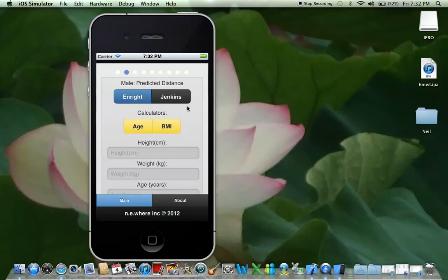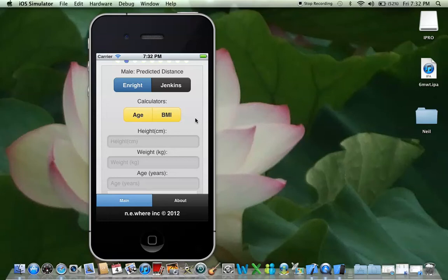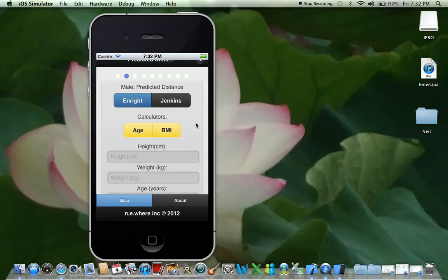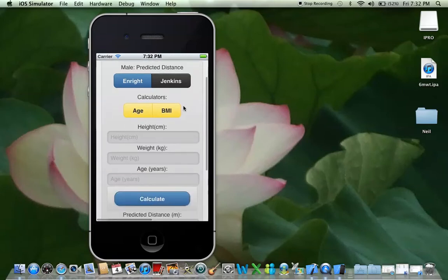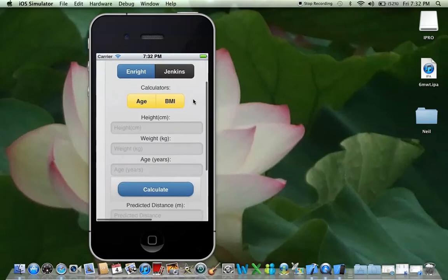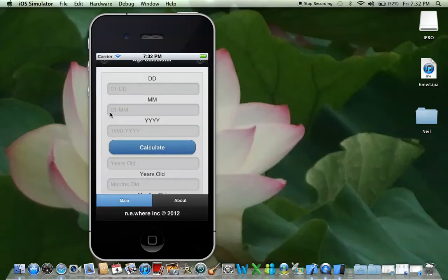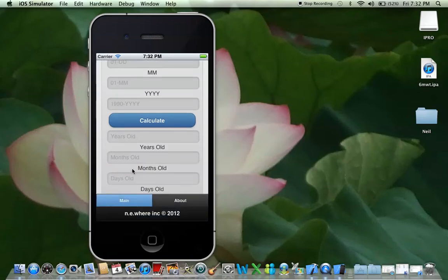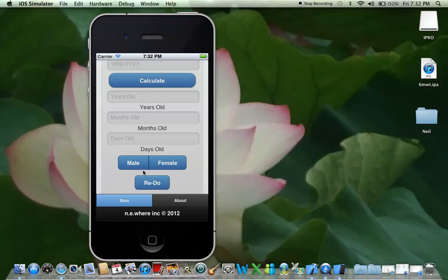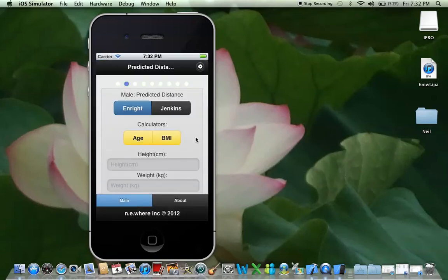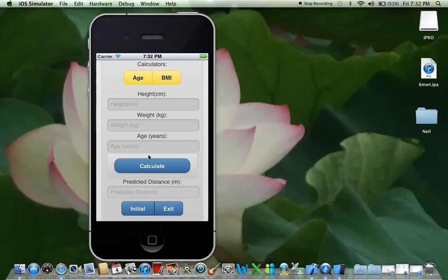This is your predicted distance calculator, where you can use the Enright formula and the Jenkins formula. If you don't know what those are, you probably shouldn't be doing a walk test. There's a bit more detail on my website, which is also in the about menu. You've got an age calculator here — I put a shortcut to it because I'm really bad at calculating ages. You can put in the client's date of birth, calculate the age very accurately, and then transfer how old this client is depending on whether they're male or female. If I pressed male, it would transfer that age back to the distance formula.